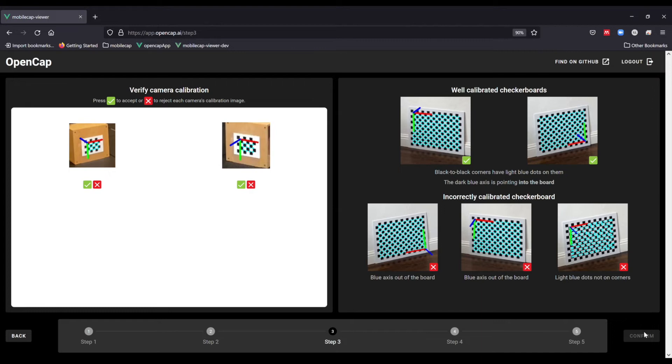You will also see a reference frame in either the upper left or lower right of the checkerboard. The important thing to check for is that the blue axis appears to be facing into the board. In this calibration, the first image on the left has the blue axis pointing into the board, so it is correct.